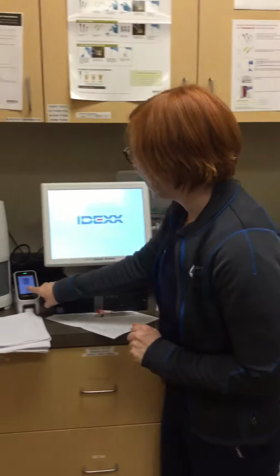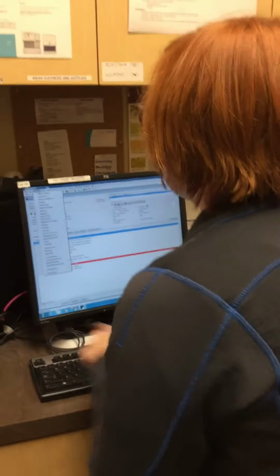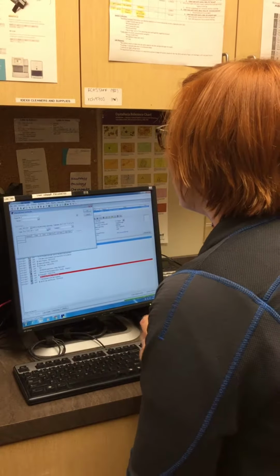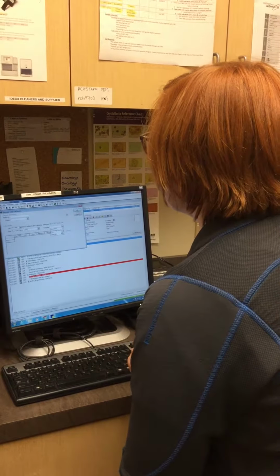Okay. So the snap test is finished, so you can see here that it's negative for lepto, and they save the results. So to put it in the computer for a chart, I go under her chart, activities, lab work, manually enter results. Then it's set on the doctor. Then I scroll down here for snap.